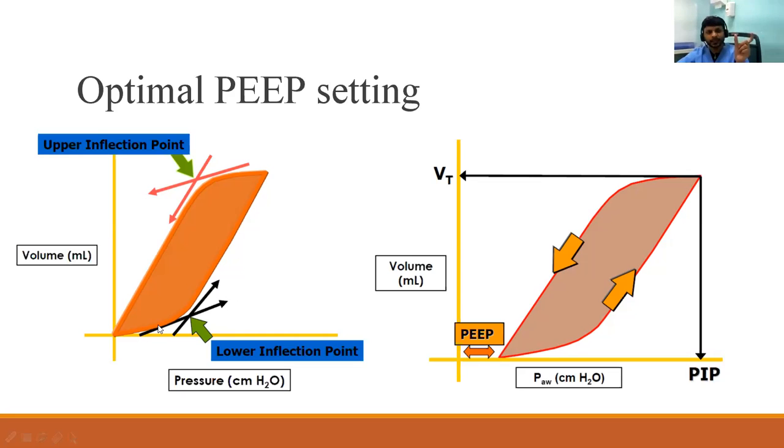So the moment you see this is the amount of pressure at the inflection point in the lung, then we know that that is the PEEP we need to use for the lung. So traditionally we use around 5 or 6 PEEP, but when we look at the particular loop in the lung, it can also help us understand, can it be lowered or should we use higher?